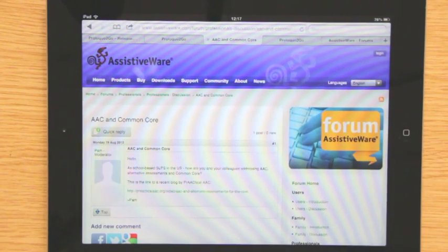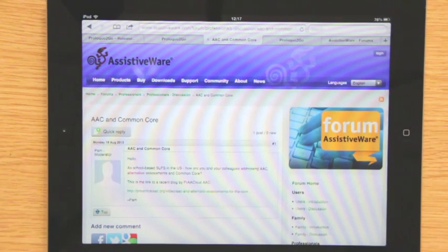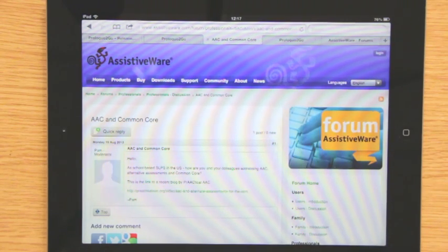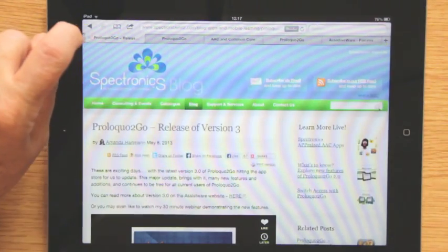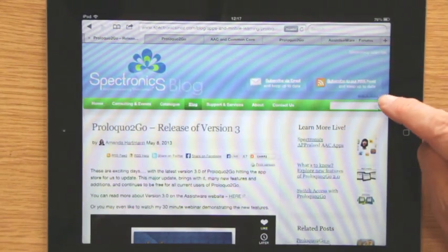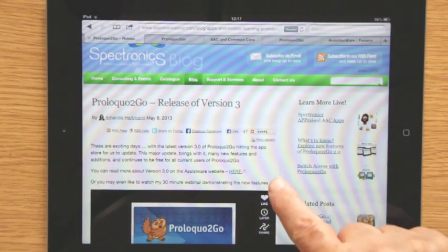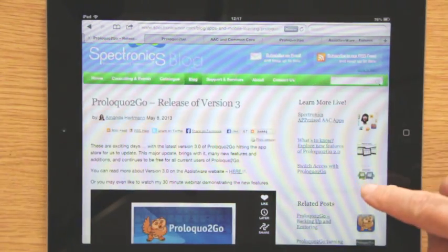There are also supportive videos elsewhere. You could actually look on YouTube and probably find videos about Proloquo2Go, but the information is probably more reliable and more focused on the AssistiveWare website. Another very good website is Spectronics. That's actually from Australia. The Spectronics blog has got lots of useful chunks of information. So there's a new one here about version 3 and the things that are different in version 3. And there are other things in the past.